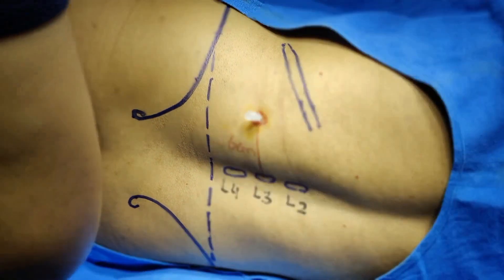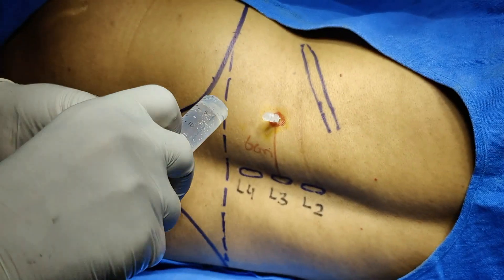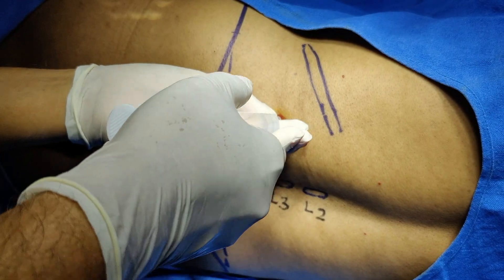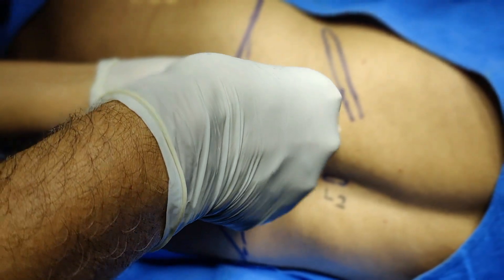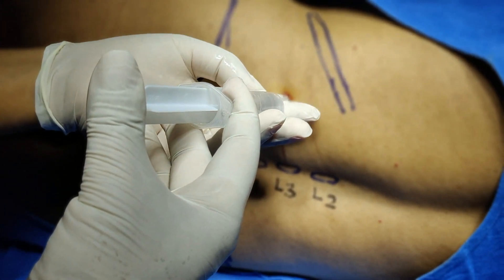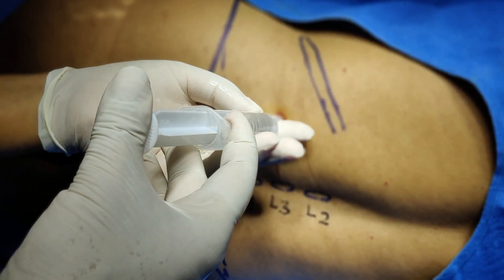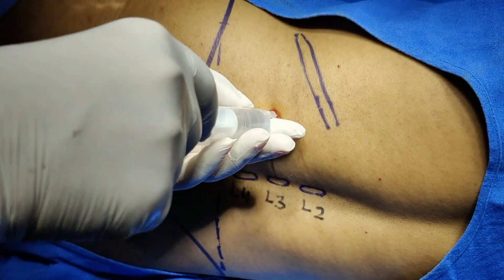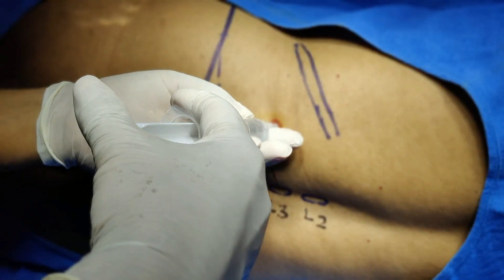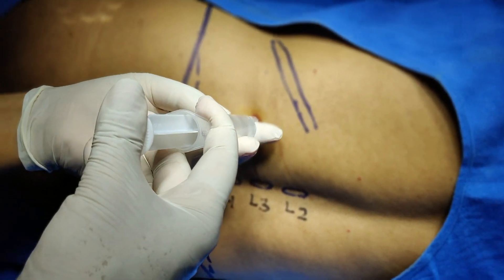Now I will inject 20 ml of solution. I have already injected 3 ml. Take the BD syringe, lock it, stabilize the needle, and inject — there should be no resistance. Keep watch on the pulse and maintain verbal contact with the patient. Go slow, rotate, aspirate, move, aspirate, rotate, then inject.